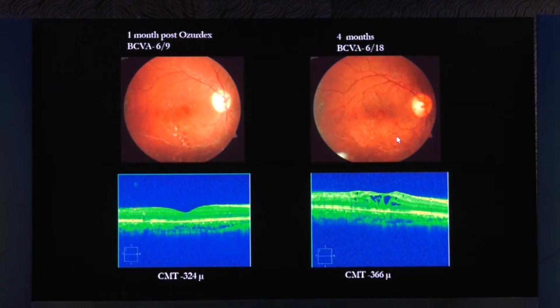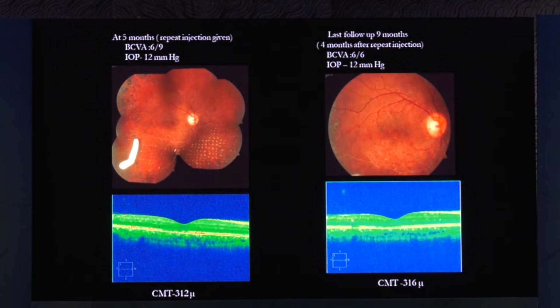Post Ozurdex, the edema subsided. But at 4 months it came back again, so we gave a second injection. And we did a repeat angiogram and did laser of the CNP areas.